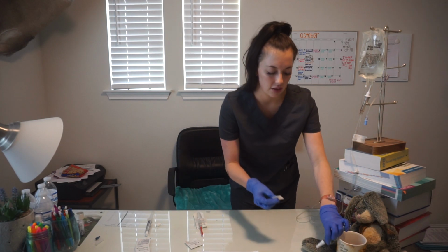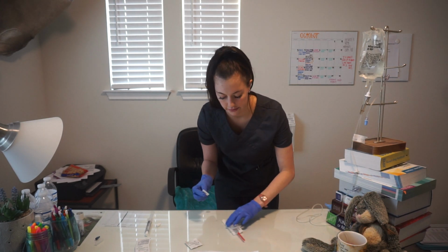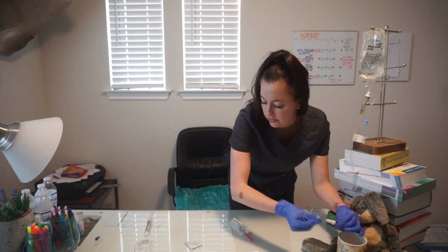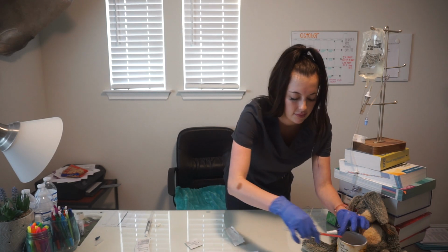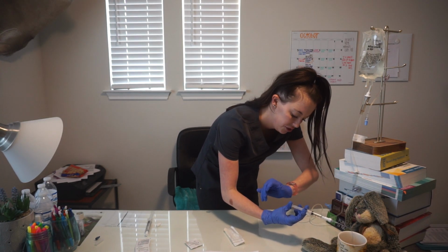So here's your labetalol, or actually, I'm going to scrub this for 15 seconds. Okay. And I'm going to push this for 2 minutes. Your 4 mLs for 2 minutes.